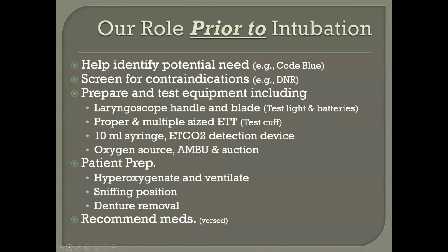And then recommending meds. Different hospitals have different criteria for that. If it's a rapid sequence, it's not just going to be a sedative. It's also going to be a paralyzing agent such as succinylcholine. But things like recommending medications, we're able to intubate as long as we're not doing a rapid sequence. If we do a rapid sequence, the attending physician has to be there. And many times that'll be done by the attending physician or by anesthesia.